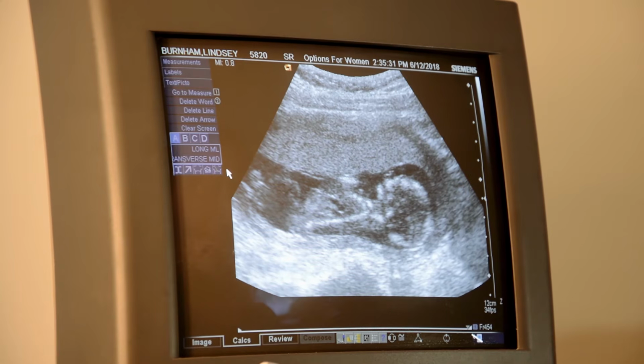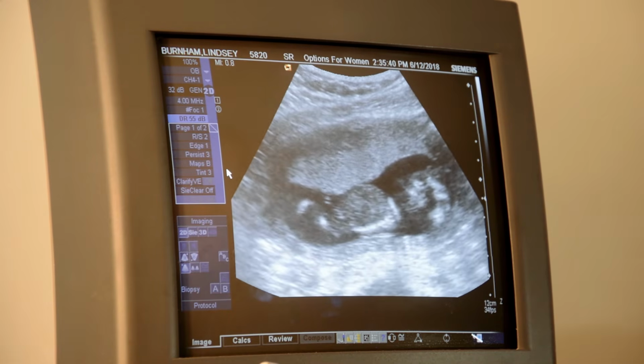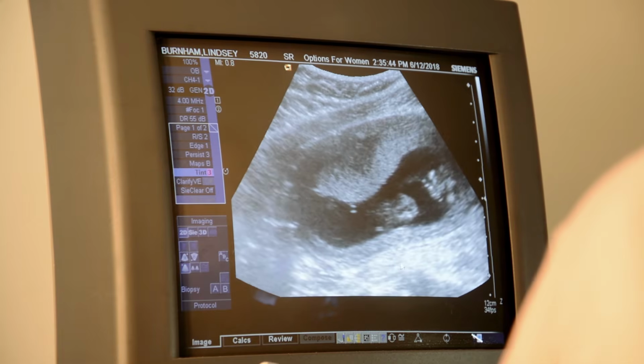Oh, that's a cute one. That's a good one too. He's laying on his back, looking straight. Good profile. Whoever's facing us. Oh, look at that. That's him. Cute. Check it. Take your ear and show them different parts on it.